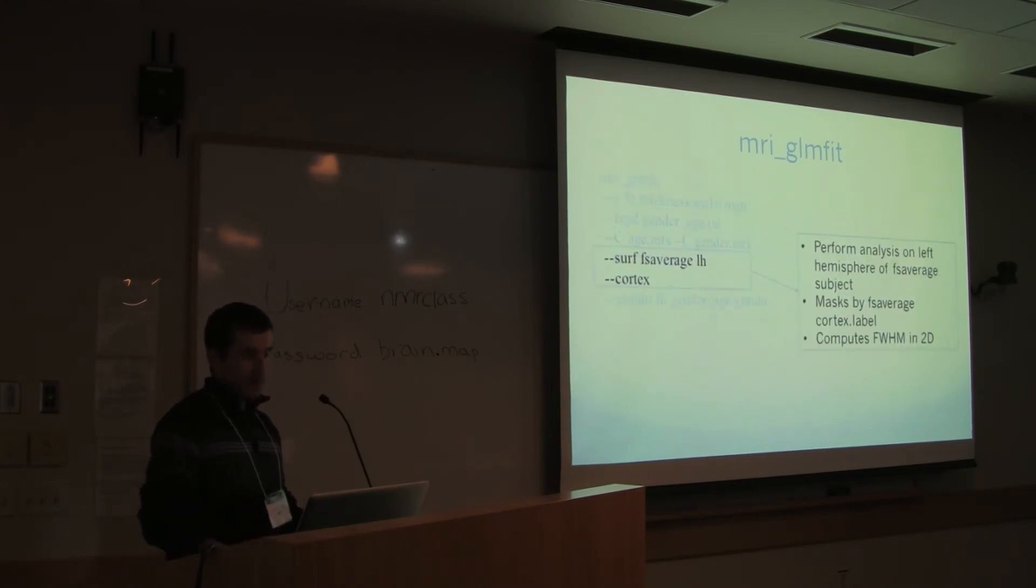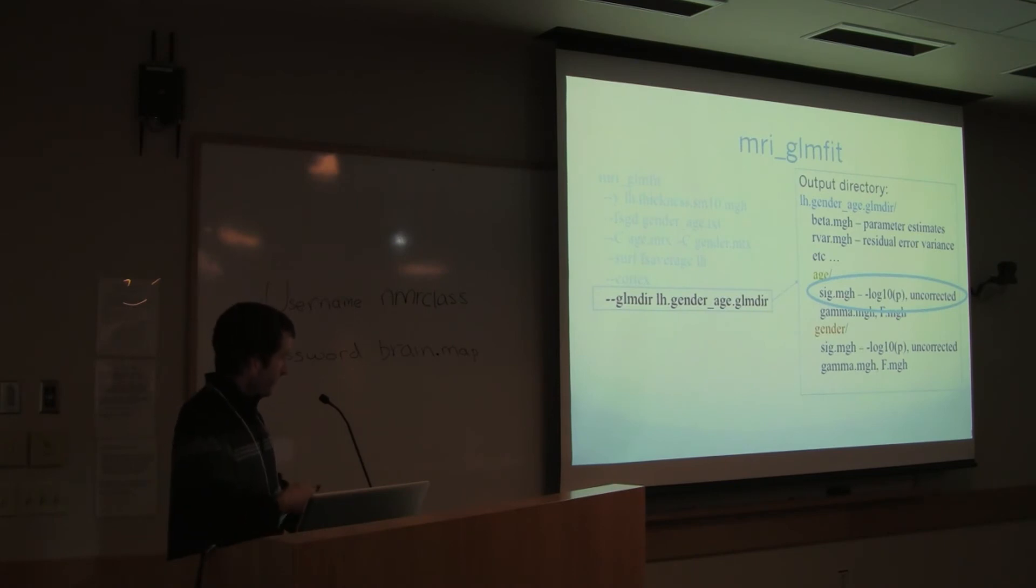So after you run MRI GLM fit, it's going to create this directory. And in this directory, you're going to have all these interesting files with beta and the variance. You can explore this later in the tutorial. And it's also going to create one subdirectory per contrast. In this case, because we have minus C age MTX and minus C gender MTX, it's going to create two subdirectories, age and gender. And within each one, we're going to have the significance map, which is what we are usually interested in.